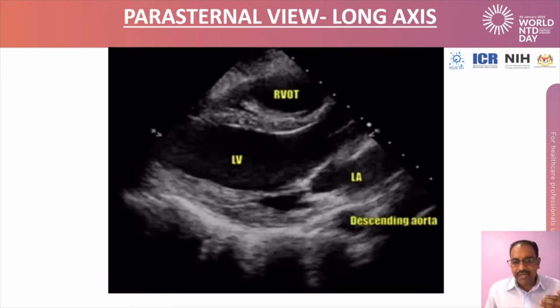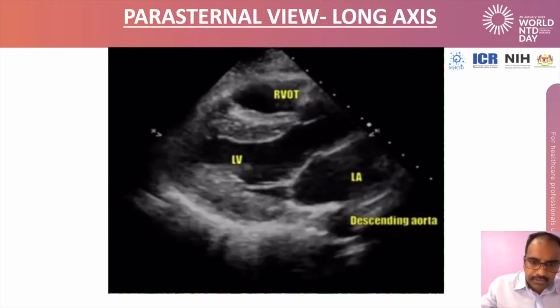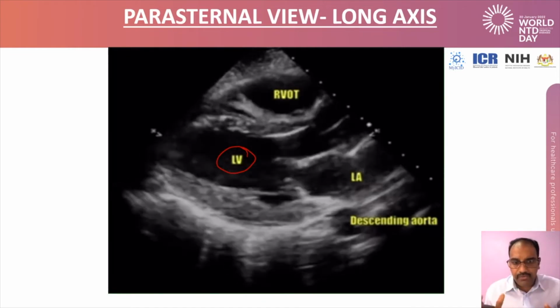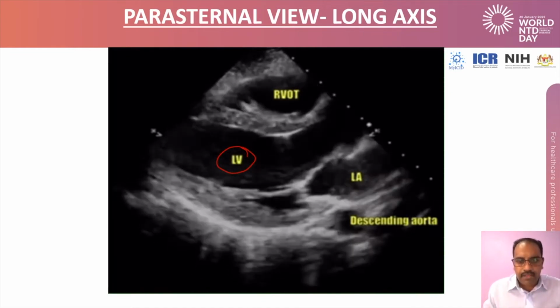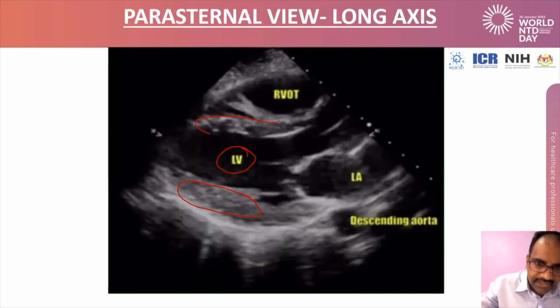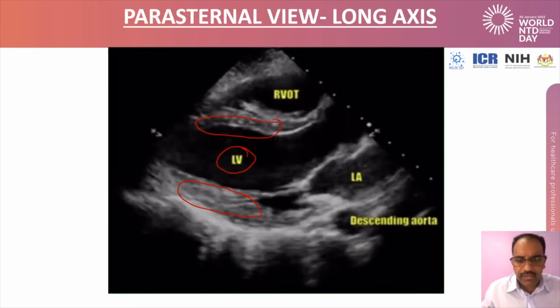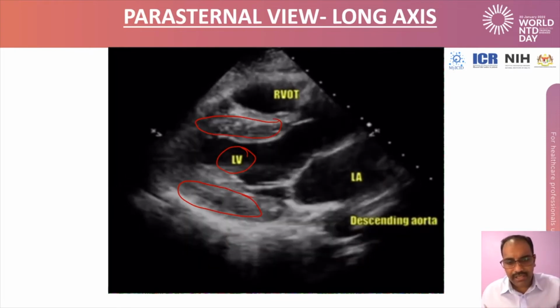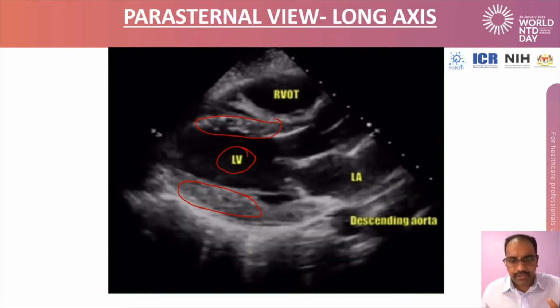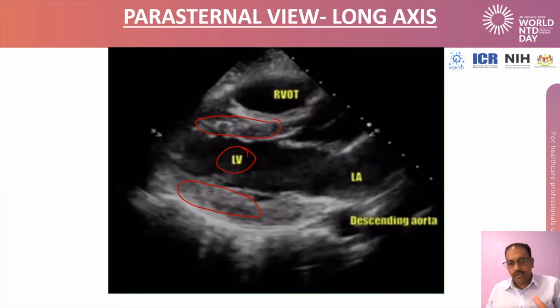As I play the video, I will explain the findings here. This is a normal echo. So you can see here the LV. That will be our main focus in this presentation. And you can focus on this wall. This is an infralateral wall, and this is an IVS wall. We are not going to look much into the mitral valve pathology, LA pathology, or right ventricular outlet. We are going to mainly focus on the LV. So this will be a normal echo.